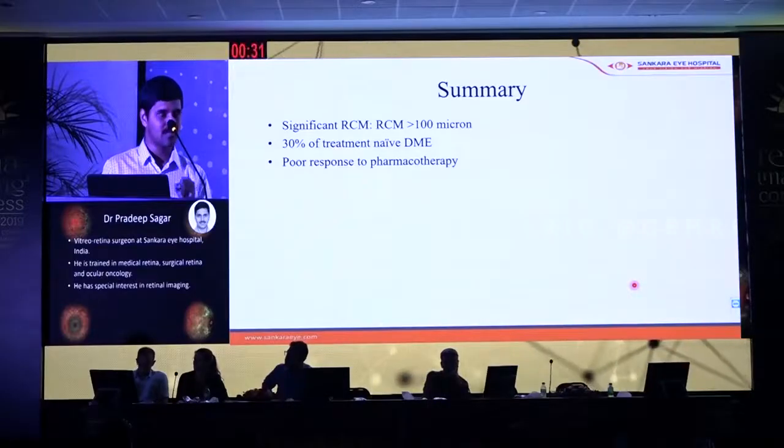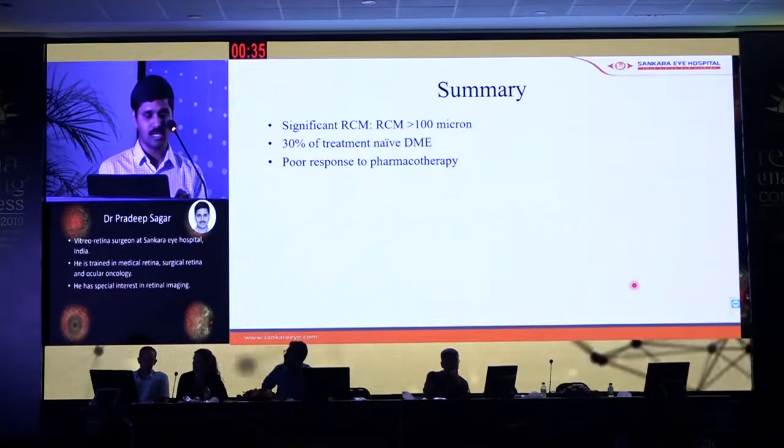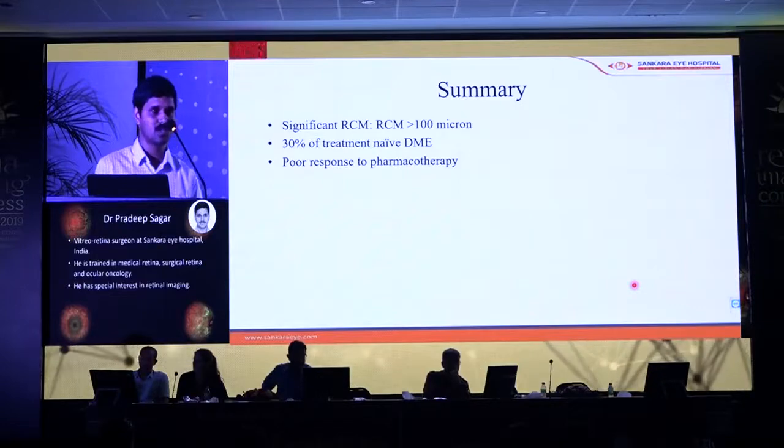To summarize, we considered an aneurysm more than 100 micron in DME as a significant RCM. They were present in close to 30% of treatment naive DME, which is quite a huge number, and they are associated with poor response to pharmacotherapy.